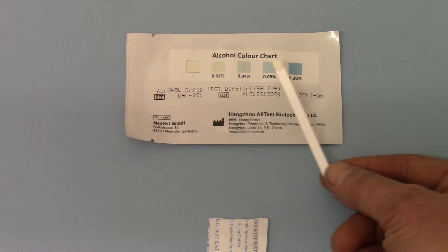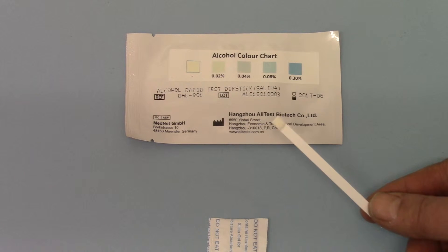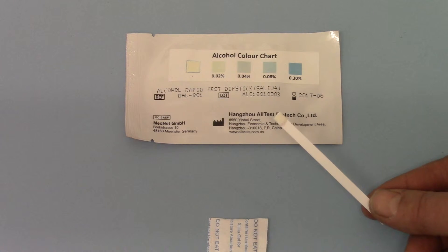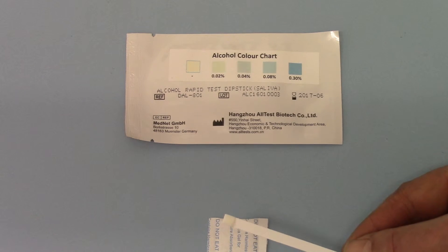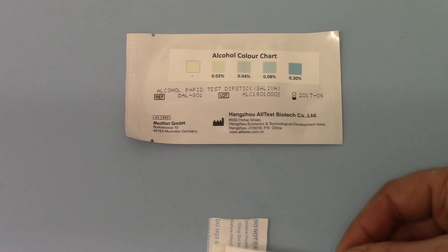By comparing the color change on your pad after it's been dipped in saliva for two minutes, you will get an indication of the actual blood alcohol concentration corresponding to one of those five readings, giving you a real-time alcohol level in the blood at the time the test was taken.